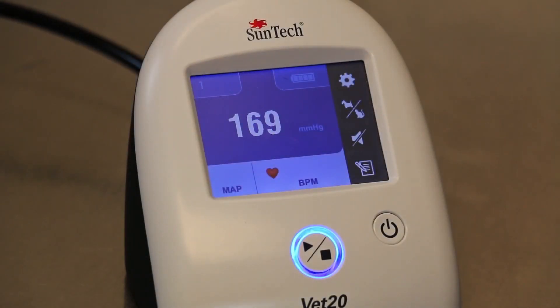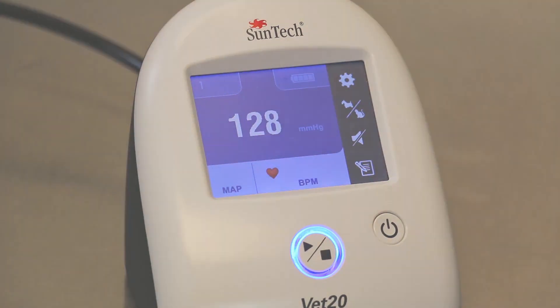Measurement data can be compared to clinical limits, which can be set up prior to taking BP measurements. Values outside of the clinical ranges will be read on the main screen.